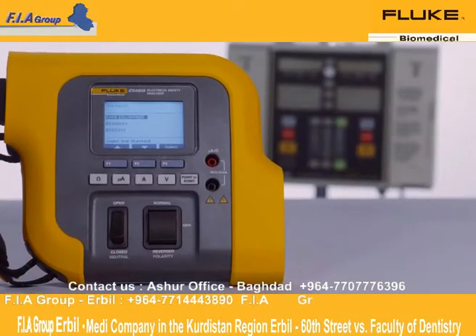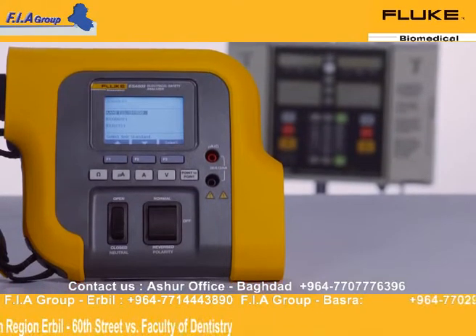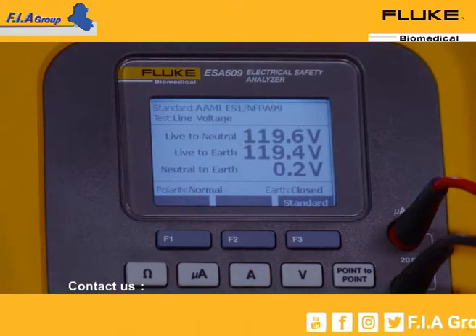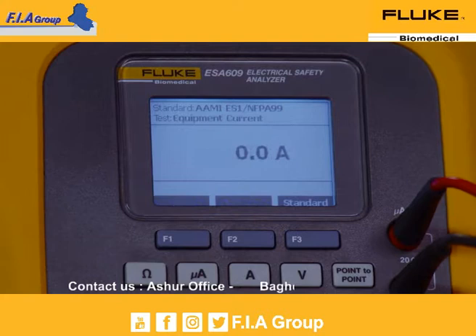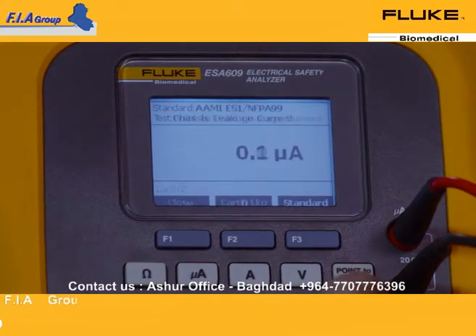Let's take a closer look at its basic testing capabilities. The ESA-609 integrates all functions needed to test medical devices when patient lead testing is not required, including line voltage or mains, ground wire resistance or protective earth, equipment current, leakage current, and point-to-point tests.